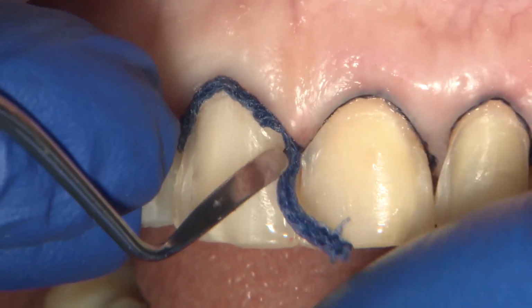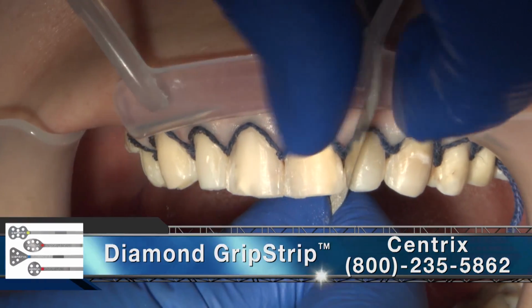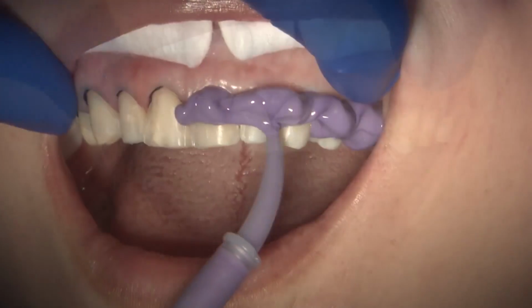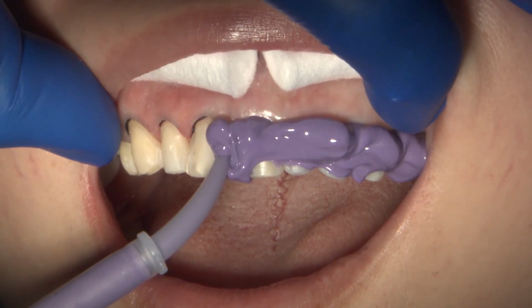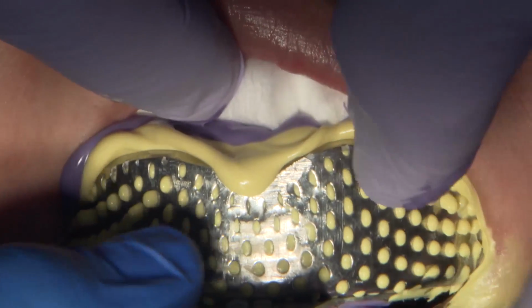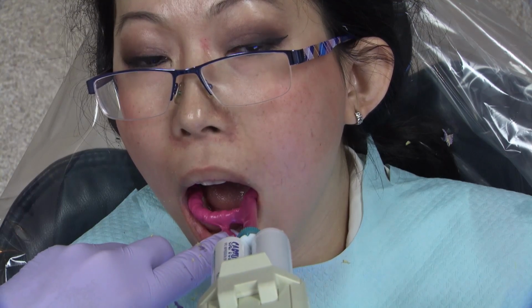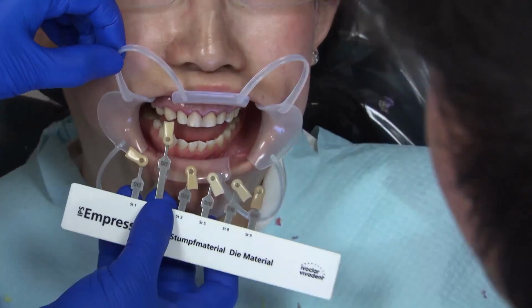Before taking the final impression, I use a grip strip to carefully separate the interproximals so that the technician could see the margins. After removing the second cord, I use Capture Vinyl Polysiloxane Impression System. Here I'm syringing medium body on the prepared teeth while my assistant was loading up the tray. A full arch impression tray was filled with Capture Heavy Body. The impression was left to set in the patient's mouth for 3 minutes. Also, a hard bite was taken with Capture material. In order to better communicate the shade to the lab, a stump shade was also taken.